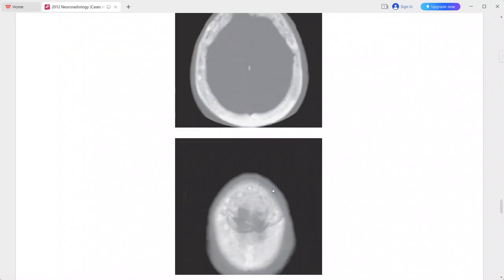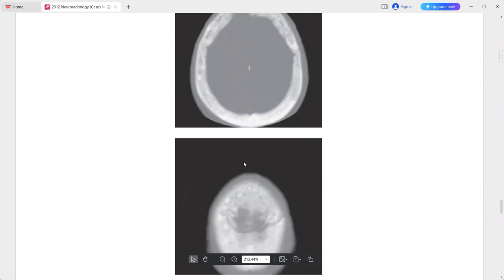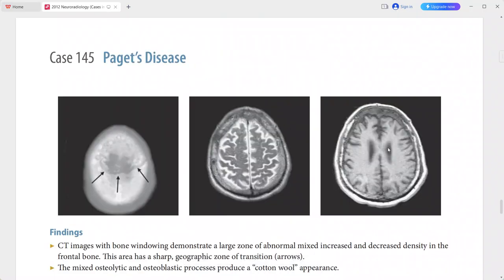On T1-weighted MRI, there is abnormal hypointense signal in the marrow space, and on T2-weighted MRI the signal is heterogeneous. This is a case of Paget's disease. Differentials include fibrous dysplasia, metastasis, multiple myeloma, and hyperparathyroidism.